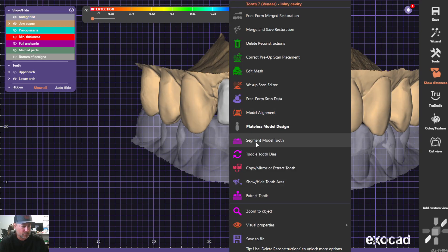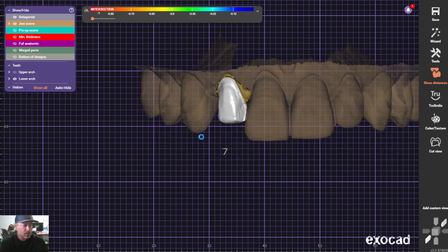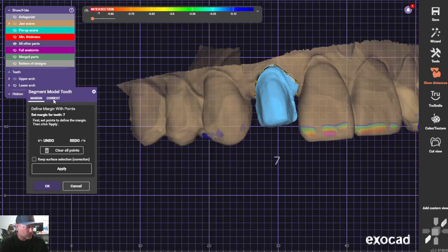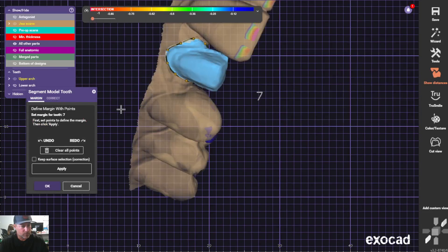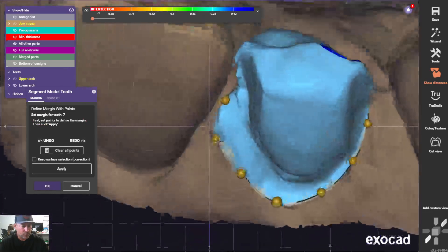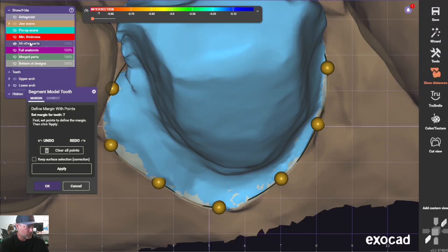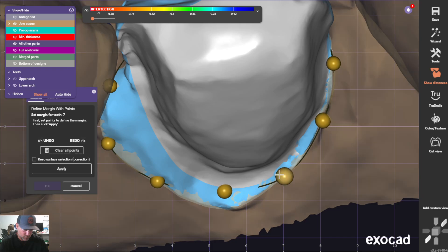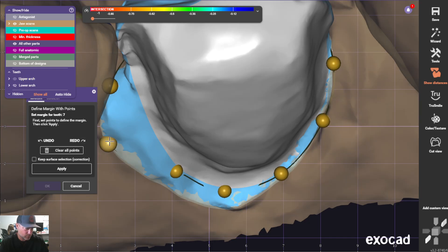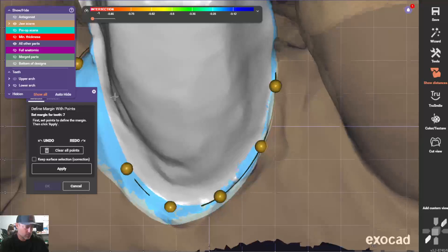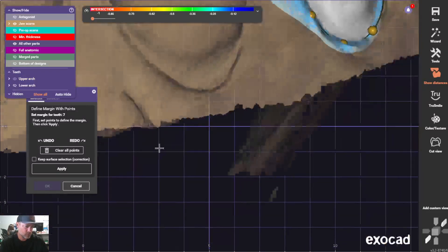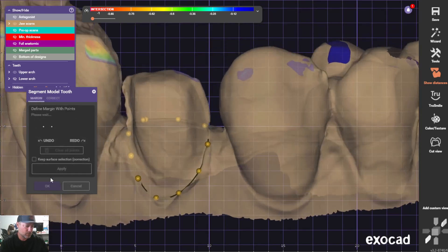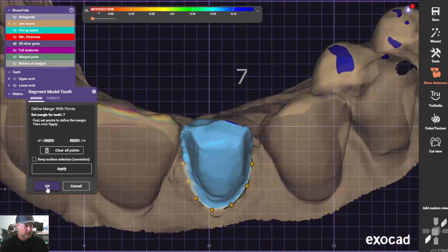We'll go ahead and segment the die first — that's not always correct, so we can adjust this margin. Pull up our settings here and hit Apply — perfect.